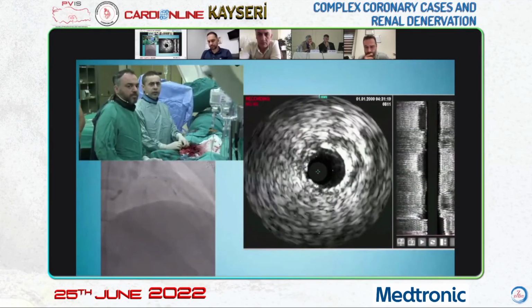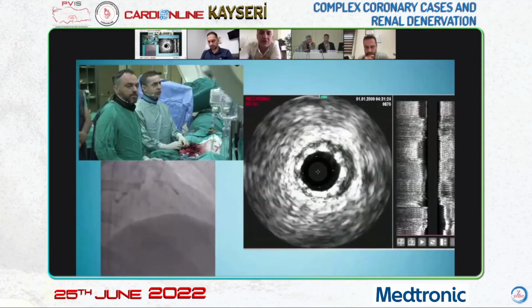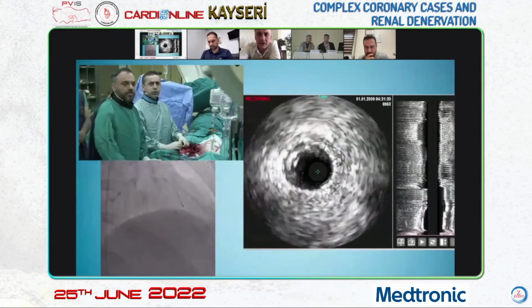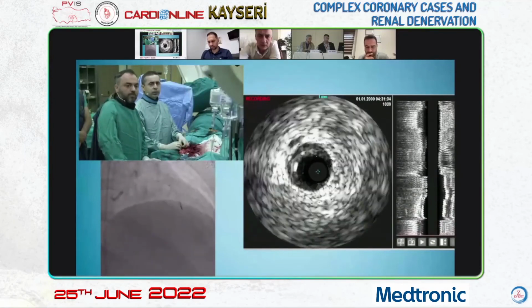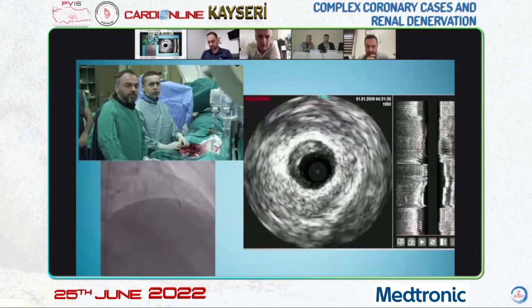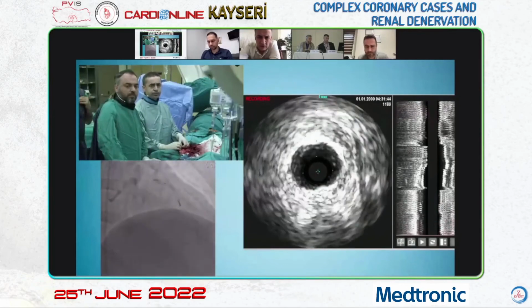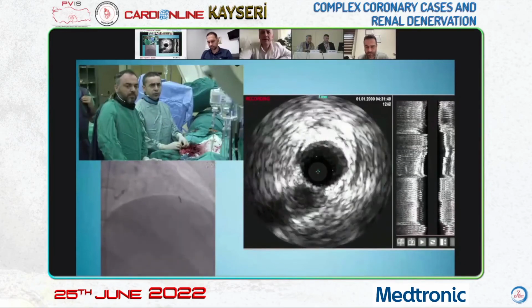We see that the angle is there. So I go to the starting part with the dissection, very small, slowly, millimetrically. Of course, if this is more than 60 degrees, it requires the stent indications.